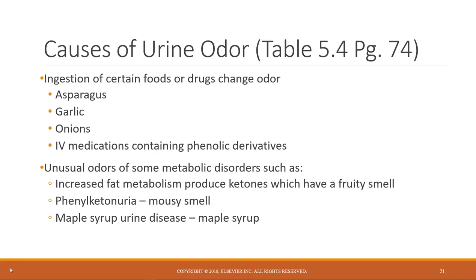Phenylketonuria, the urine has a mousy smell. I want to ask you this. Do you know what a mouse smells like? I don't. So they do describe this as a mousy smell, and I guess if you've smelled enough of them, you would be able to recognize that. Maple syrup urine disease, believe it or not, these patients' urine smells like maple syrup.